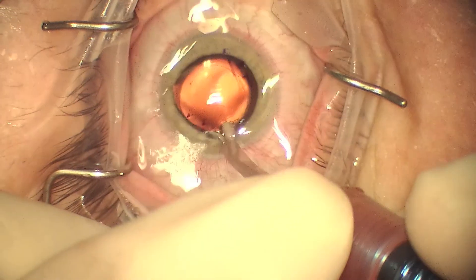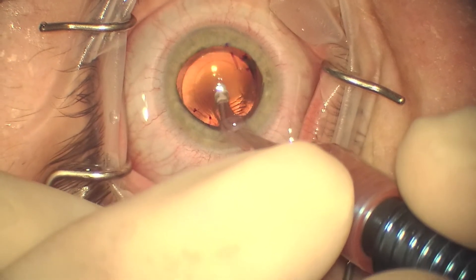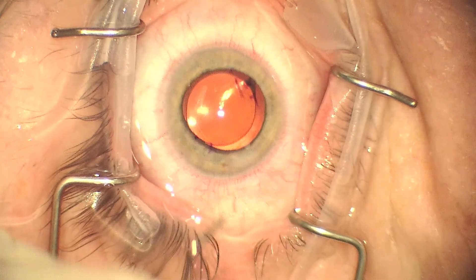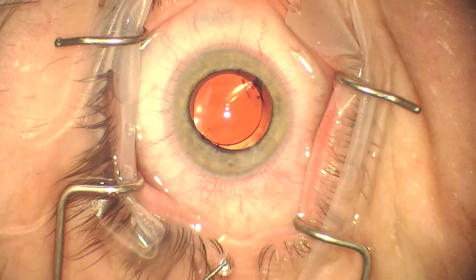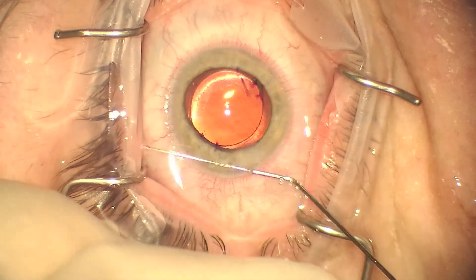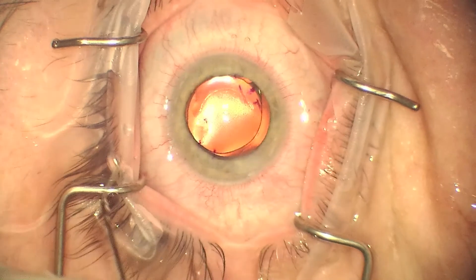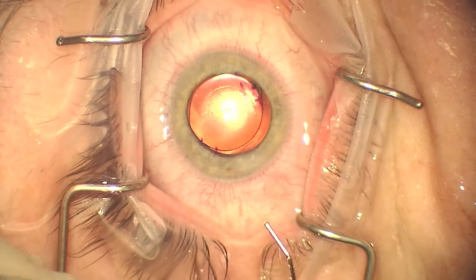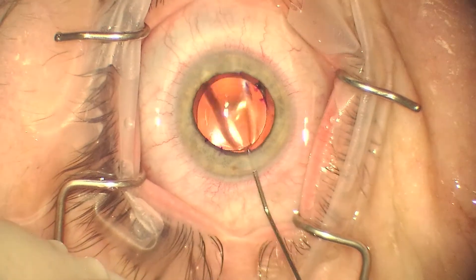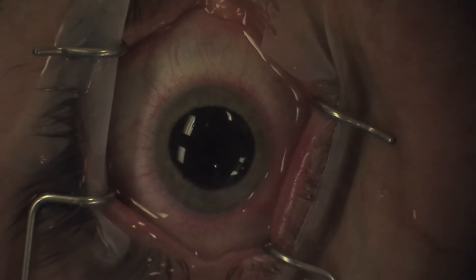Viscoelastic removal is performed with irrigation and aspiration. In this case I did not put new viscoelastic behind the IOL because the IOL rotated so easily. Once the viscoelastic is removed, the wounds can be hydrated and the centration of the IOL confirmed. You can see that the capsulorhexis is not covering the entire IOL, so the IOL is repositioned so that it is covered by the capsulorhexis. A repeat ORA is performed, confirming that there is now about one half a diopter of residual astigmatism remaining.